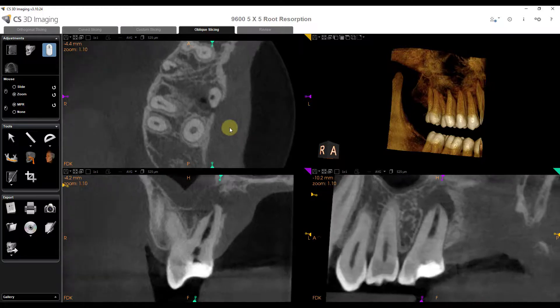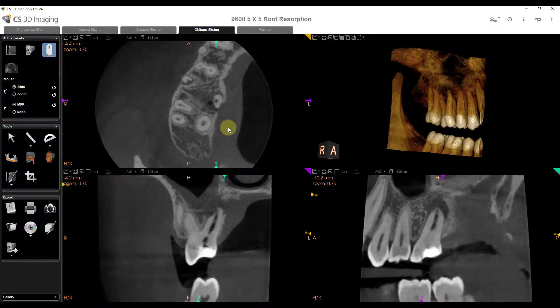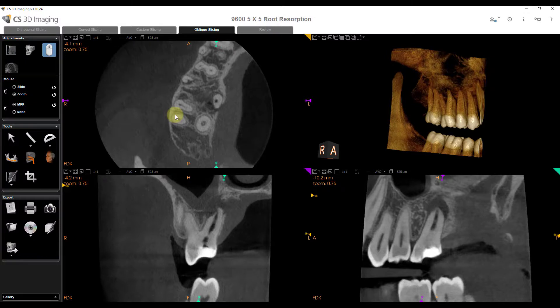Ctrl A and I can zoom in or out, Ctrl A and slice back and forth — just going back and forth quickly. Super easy tip that makes it very, very helpful and effective.